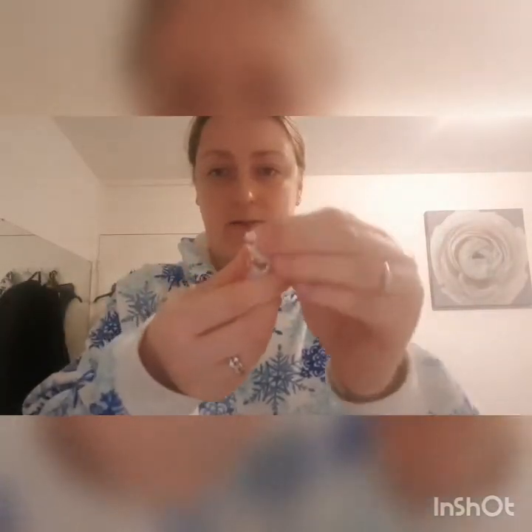First swab. So this is the one I don't do, because it's got the snap cap. People might tell me off watching this and say you should be doing it, but you just wipe the alcohol wipe over the snap cap. But I do think it's sterilised, it's not being cross-contaminated because it's been sealed in a cap. So here, as you can see, that is definitely not the injection that you would inject yourself with.